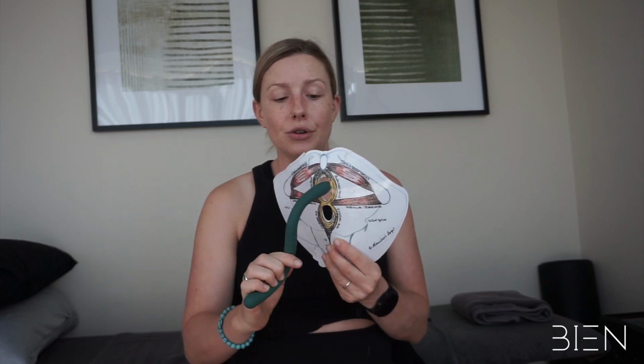You can also do it with a pelvic floor wand. So if it's more that we just need to stretch the base of the entrance of the vagina, or there's quite tight scar tissue or something that's really restricting particularly the base of the entrance of the vagina, the wand can be used to stretch it. So we pop the wand into the entrance of the vagina with a little bit of water-based lubricant or intimate gel, and then we're applying pressure in a 3 o'clock to 6 o'clock direction, and then a 9 o'clock to 6 o'clock direction. So we're kind of going from halfway down to the base and halfway down to the base.